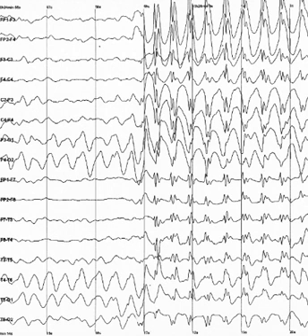Abnormal activity. Abnormal activity can broadly be separated into epileptiform and non-epileptiform activity. It can also be separated into focal or diffuse. Focal epileptiform discharges represent fast, synchronous potentials in a large number of neurons in a somewhat discrete area of the brain.